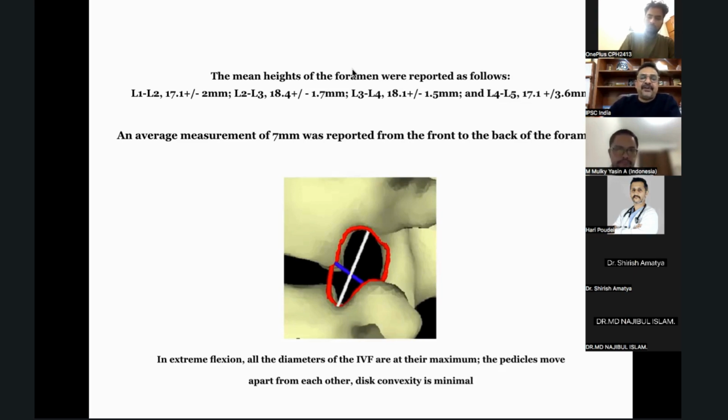If there is a stenosis over the foramen, in that case it is a better idea to go for the foramenotomy first. You can just shave off the facet over here, and then you can go inside. That is also one technique you can use. Or some people just go inside the disc. That is the inside-out technique and outside-in technique. Even with the outside-in technique, some people prefer the half in, half out technique. With that, half of the working channel is inside, and you have a good space over here.